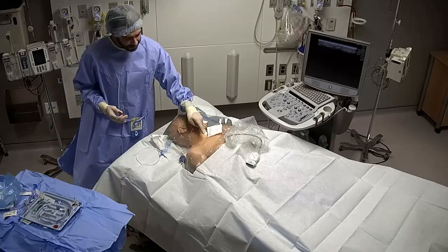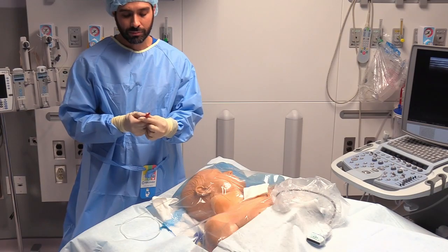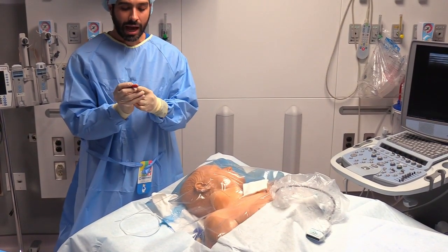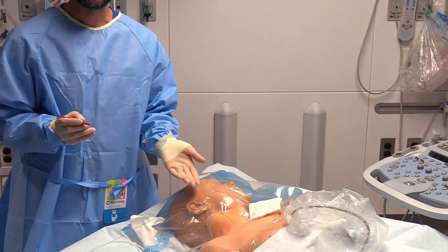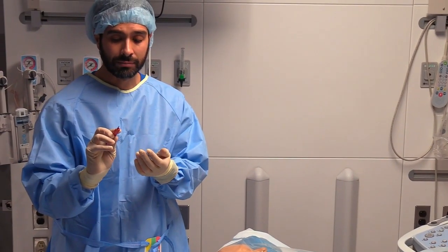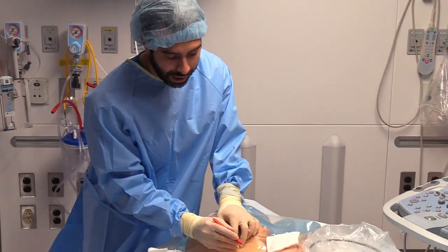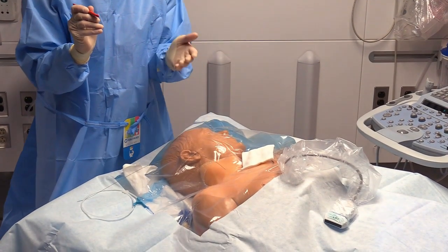Since you've numbed the skin here, right where the wire has gone in, it shouldn't be painful. I usually remove the blade from the kit there, and you're not going to cut the wire. Some people will tell you to leave the needle on as you go in. I don't do that. I usually take the needle off, and then I leave the blade here, and I'll take the non-sharp portion of the blade and ride it down the wire, and I'll point the sharp edge just slightly away from medial, because that's where the carotid is.